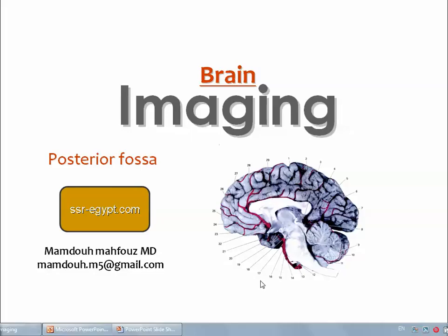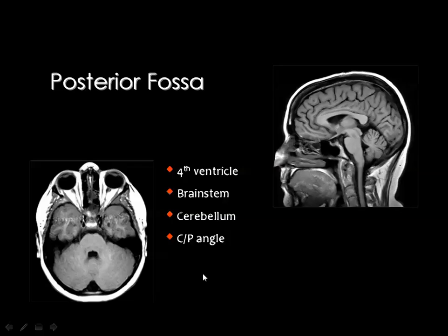Dear colleagues, this is lecture number 7 in the series of Diagnostic Radiology in English, DRE. It will deal with the imaging of the posterior fossa as a part of the series titled brain imaging. Actually, you know that the posterior fossa is a part of the intracranial structures, and all that can occur supratentorial can occur also infratentorial in the posterior fossa.